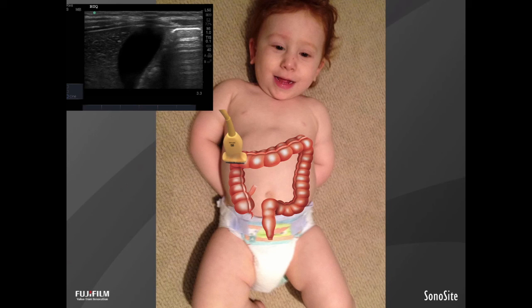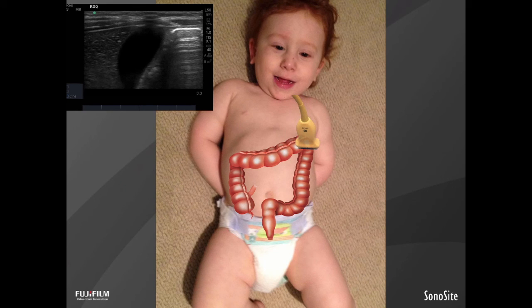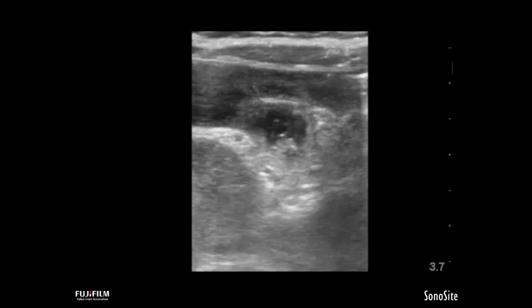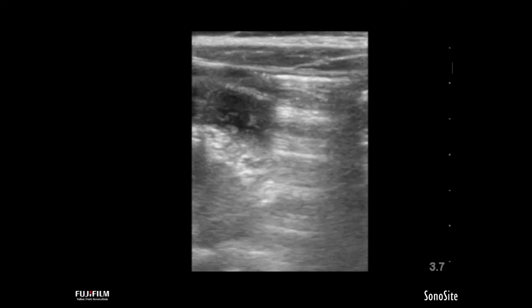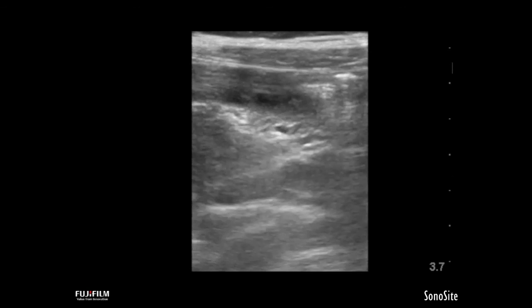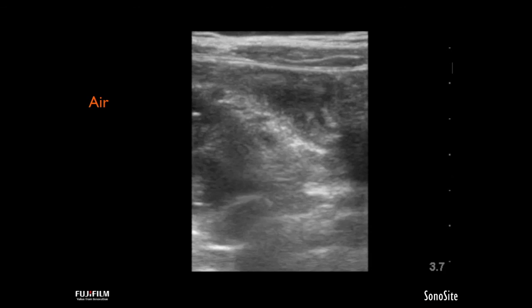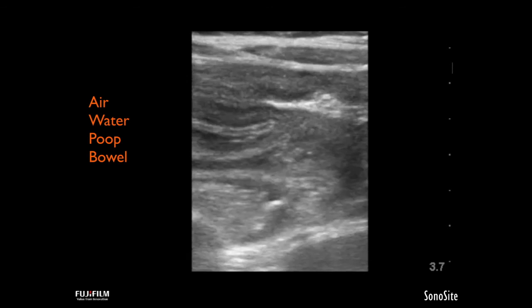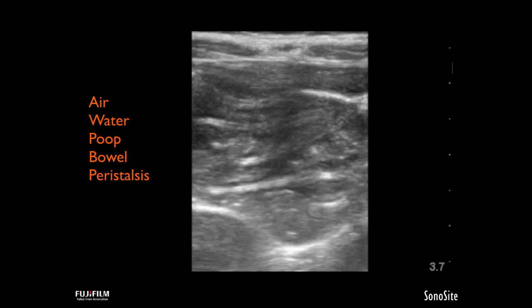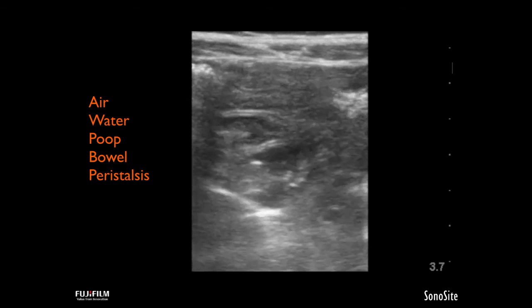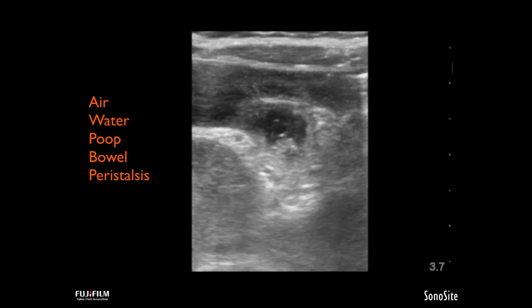We're going to rotate the probe so the marker points toward the patient's head and scan across the transverse colon, then rotate back so the marker points toward the patient's right and scan down the descending colon. In slow motion, this will appear as nothing in particular at first, but there are five really important things to see on normal bowel ultrasound: air, water, poop, bowel wall, and peristalsis. I'm going to speed this video up and identify those normal findings.